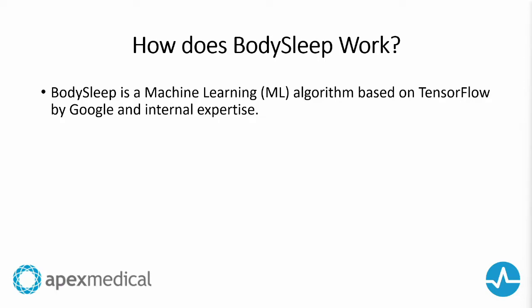The Nox team have been developing sleep diagnostic equipment since 2003, with the goal of bringing a new generation of products to support the growth of sleep medicine. The Nox T3, which you may be familiar with, was launched in 2006. Since then, we've seen the release of the Nox A1 and the Nox T3S, all devices that you might be familiar with.